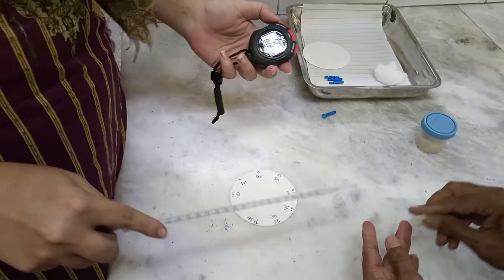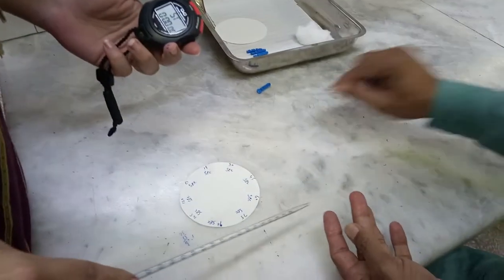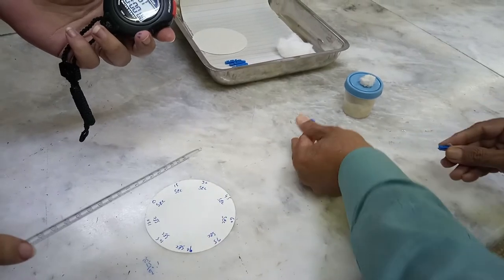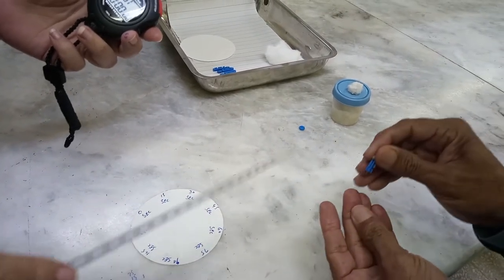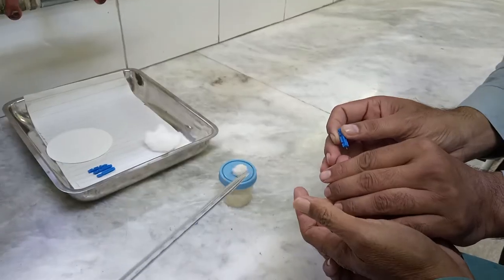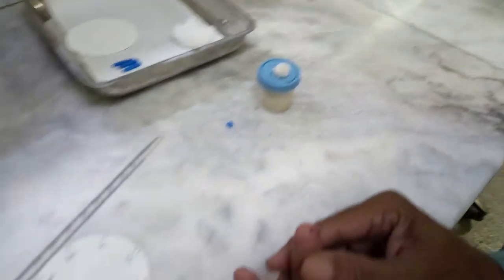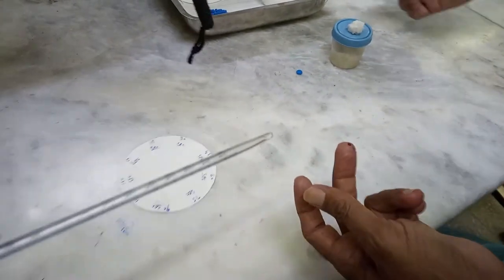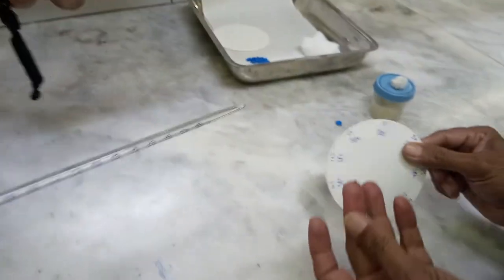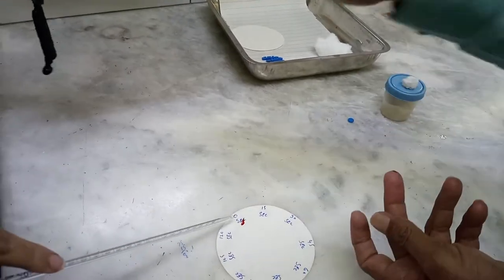We will clean the tip of the finger with the spirit swab. We will take a sterile needle and give a deep prick. Immediately, we will start the stopwatch. Then we will take the blood and put it on the filter paper and record it.